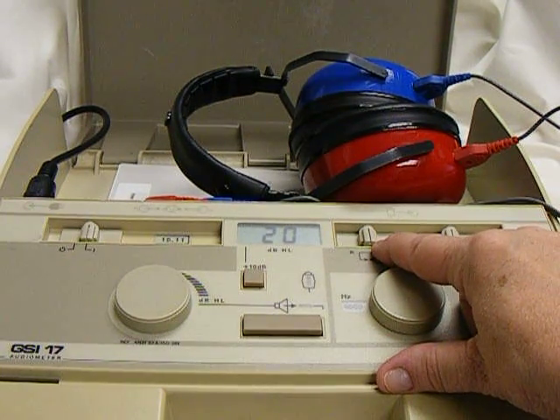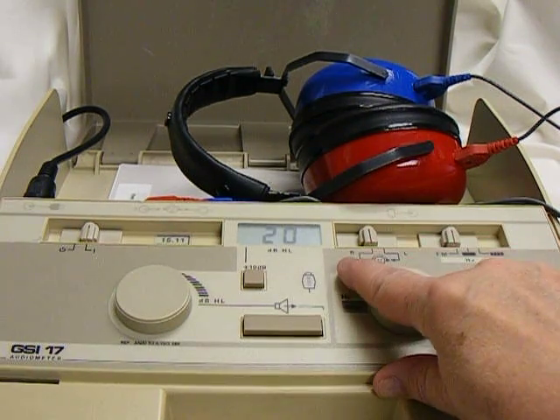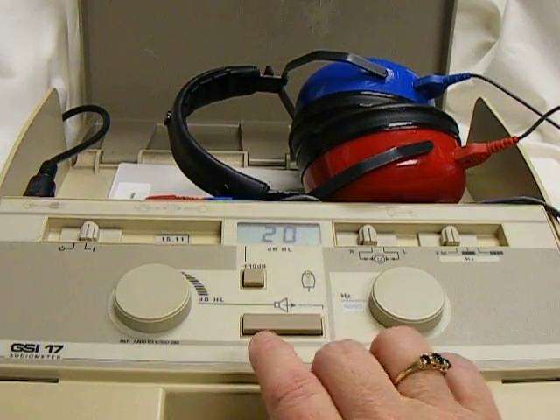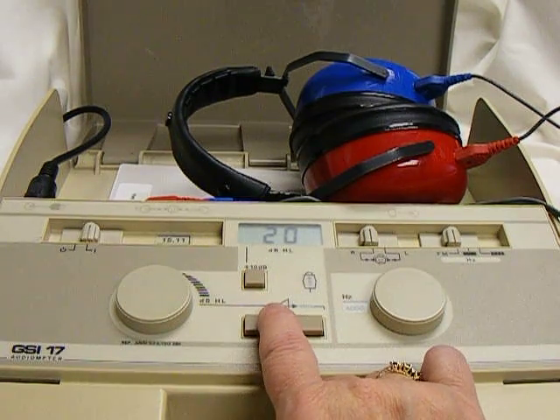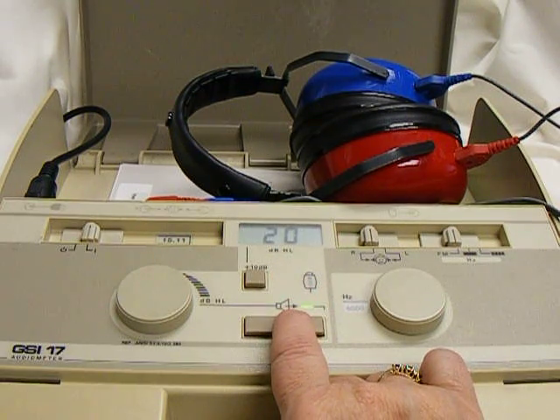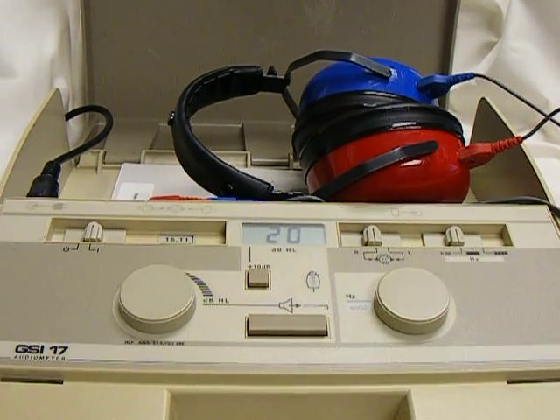This slider presents the tone to each ear — R is right and L is left. Always start in the right ear. Now to present a tone, you're going to hold down this button for one to two seconds, and hopefully the student will respond by raising their hand.